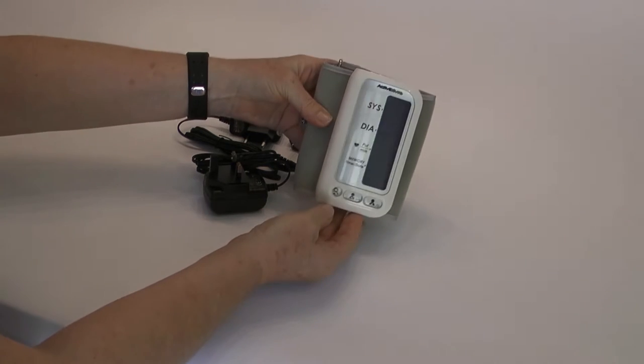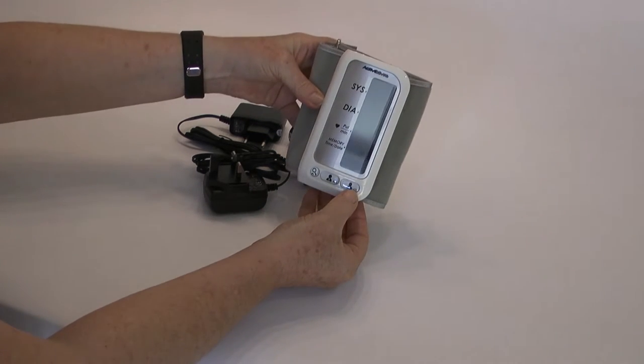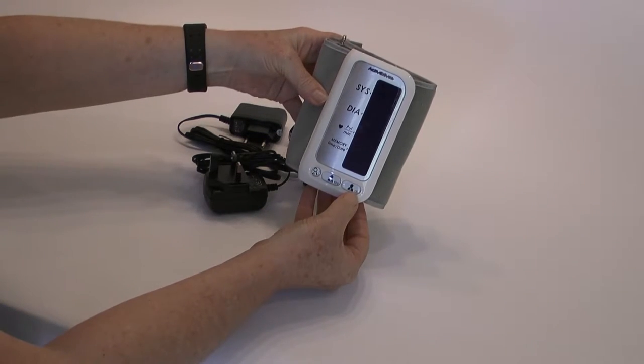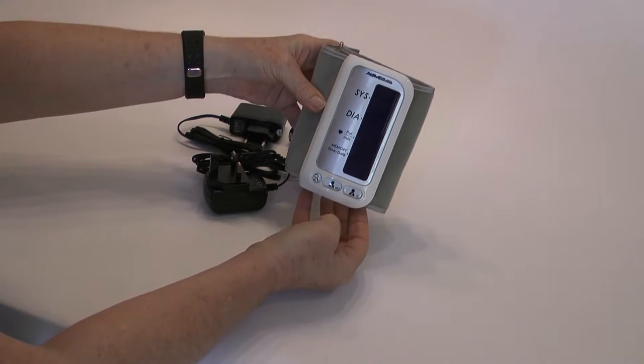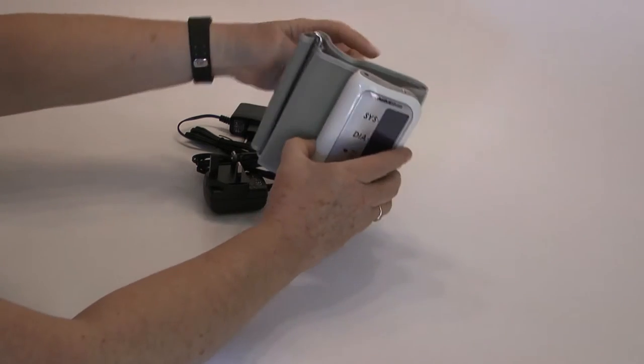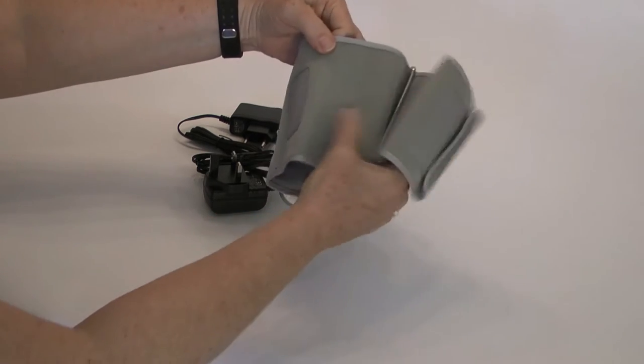There are two user buttons at the bottom of the device: user 1 and user 2. User 2 can also be used to associate a particular blood pressure monitor with your account.